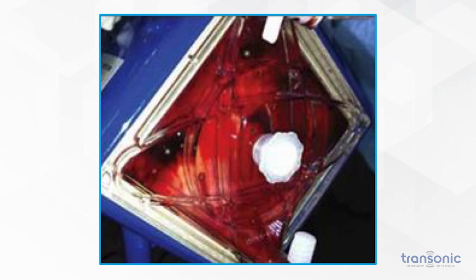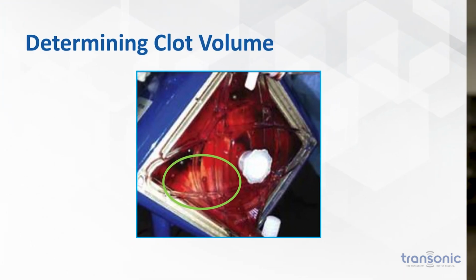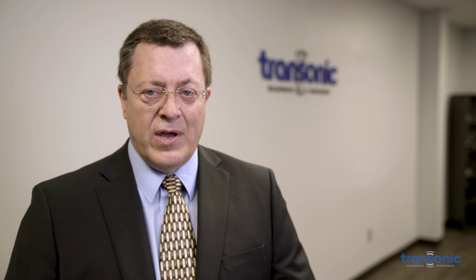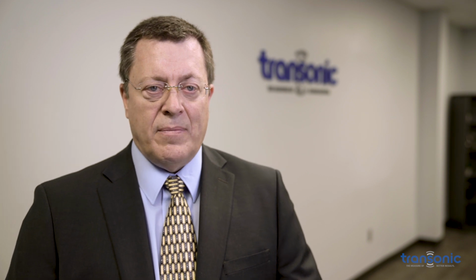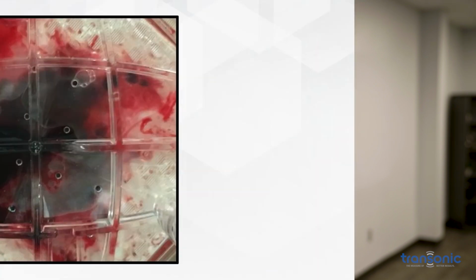Here we can see clot starting in the corners. We can also see one area of open fibers. Even a small area of open fibers like this is going to prevent the pressure climbing upstream from the oxygenator. So unless you can visualize somehow that you've got a full face of clot, you're not going to see the pressure jump. So you won't get that clue that you're looking for.